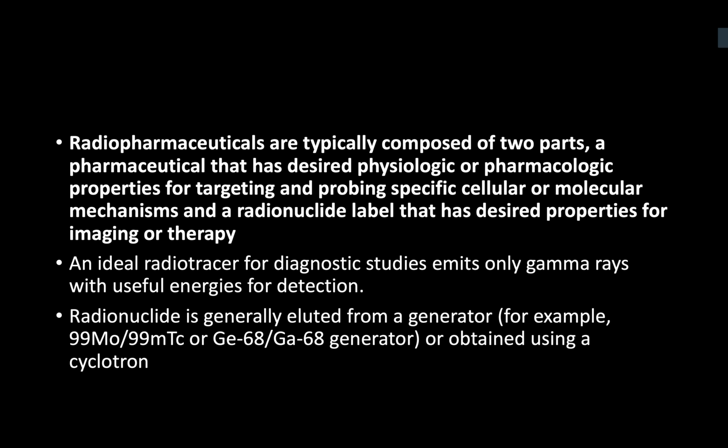So, going more towards the technetium MDP, what is technetium, and why do we have to combine technetium and MDP? So technetium is the radionuclide label which is attached to MDP. Technetium is what generates the activity picked up by the gamma camera. Its half-life, as you mentioned, is 6 hours.